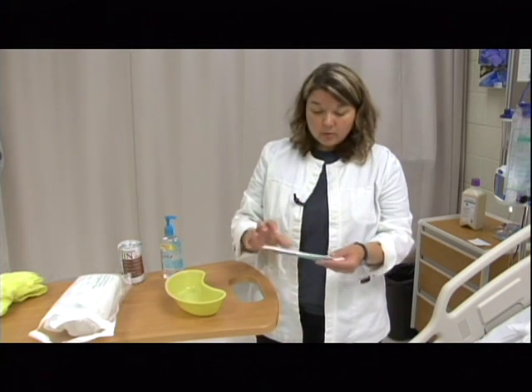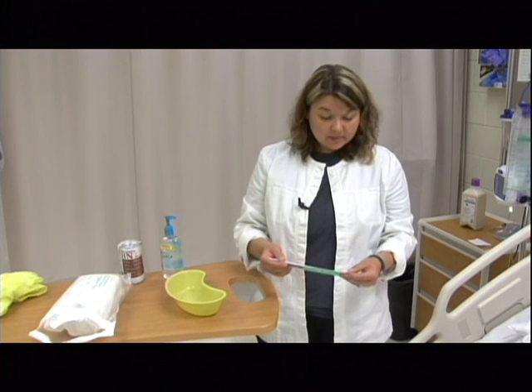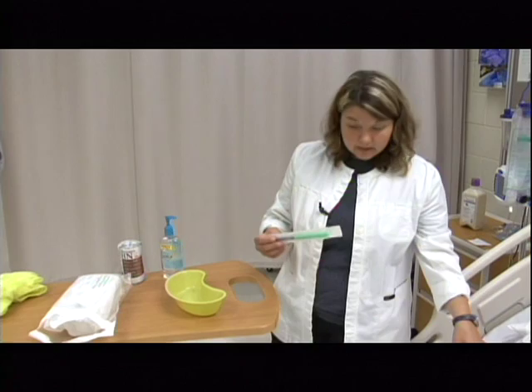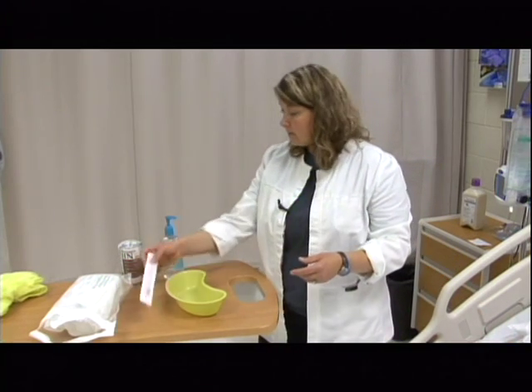And then if it's a brand new gastric tube that has been placed, whenever you first come in, you could use an indelible marker to measure and mark the length of the tube. And so this is here.